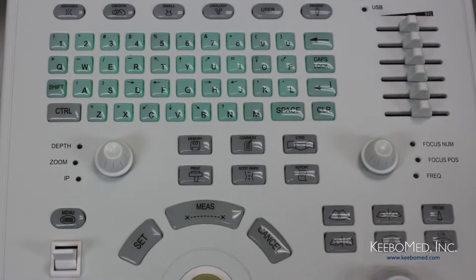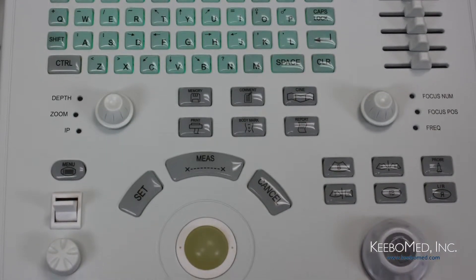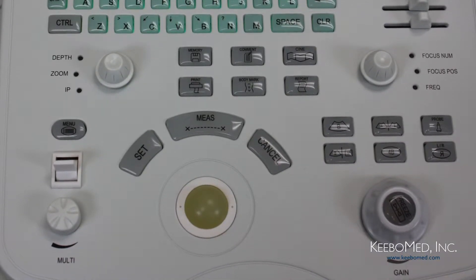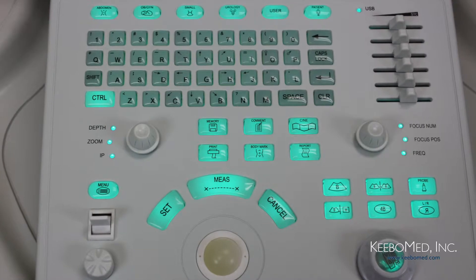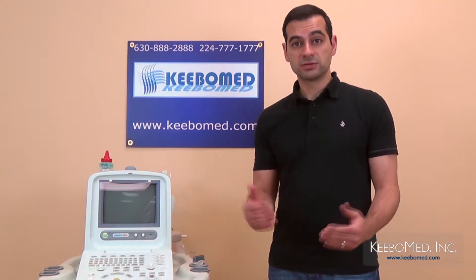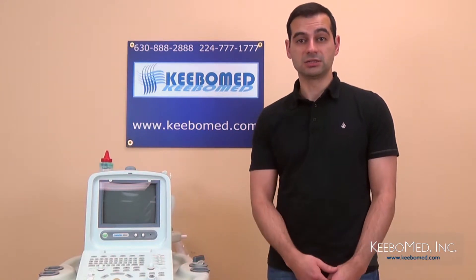Some of these one-touch keys include memory, which is used to save images, a comment key, cine save, print, body mark, and report. Also, the keyboard is backlit, which provides good visibility in darker rooms. All these various functions of the keyboard prove that using the 8300 is quick and easy.